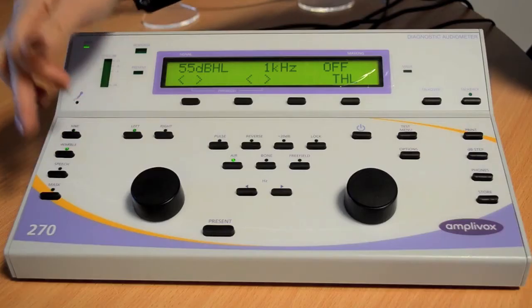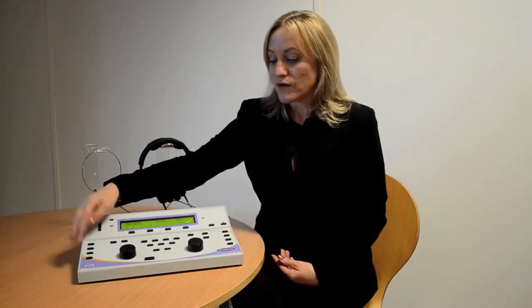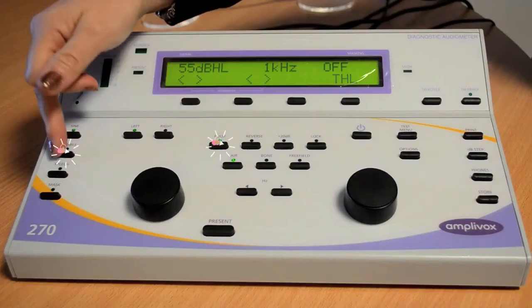You also have the option to choose what type of tone you wish to use. You can choose to use a warble tone, a pulse tone, or a combination of pulse and warble.